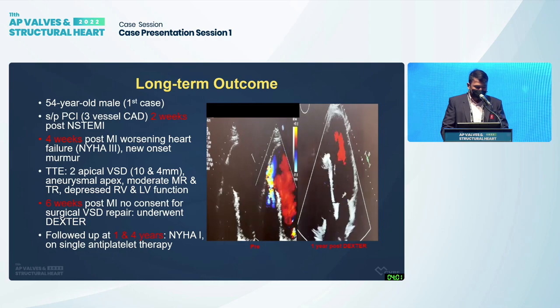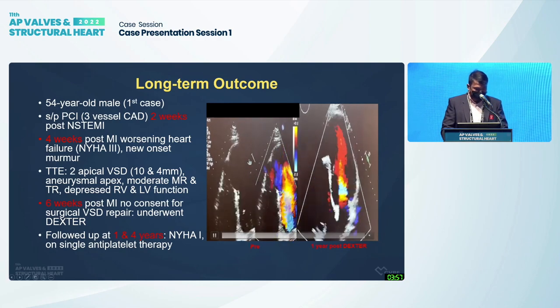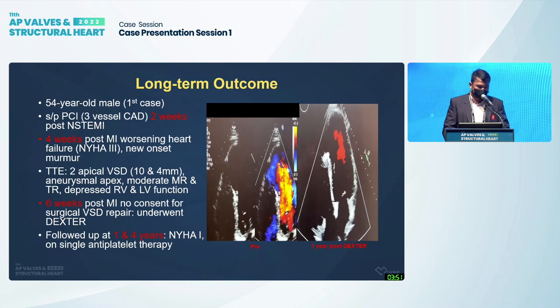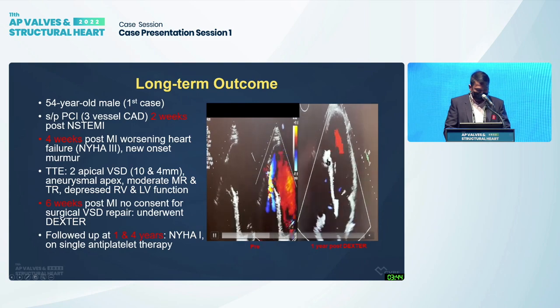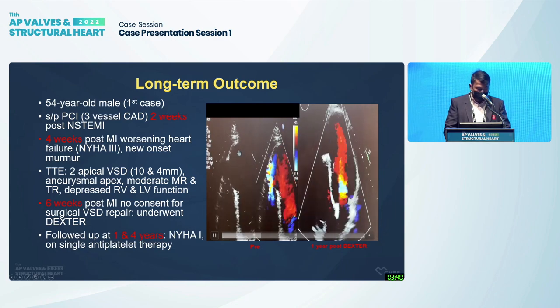Transthoracic echocardiography showed 2 small residual apical VSDs. He was actually a good candidate for surgery. However, he strongly refused, hence transcatheter therapy was offered. His 2D echo at 1 and 4 years showed an intact VSD occluder, as you can see here, and a small residual shunt, but the RV apex became part of the LV.